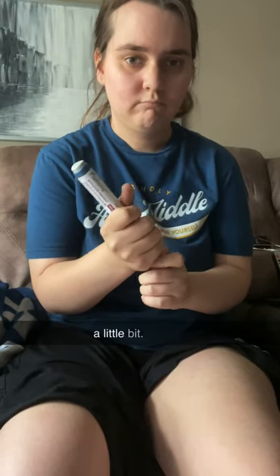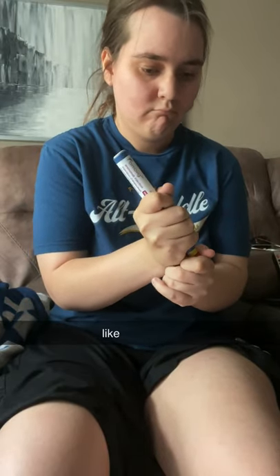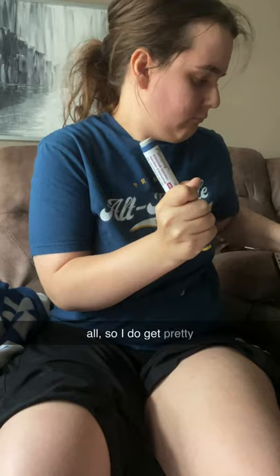All right, so the first step is for me to wipe my leg with the alcohol swab. This just cleans the area and makes sure that it's ready for the injection. You might notice me shaking a little bit — I do not like needles at all, so I do get pretty nervous.